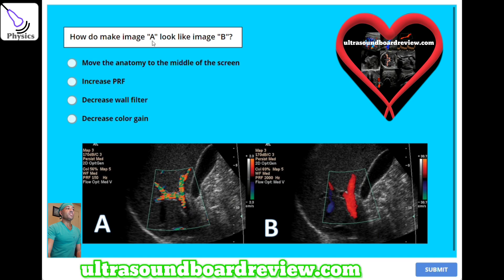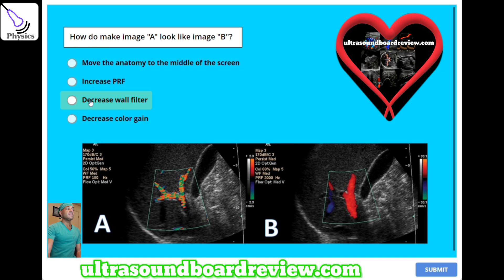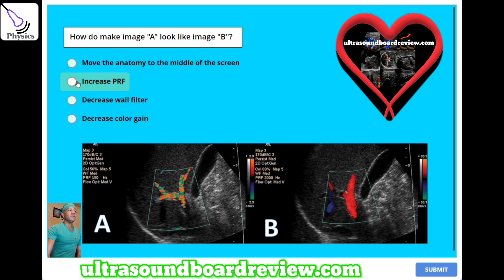How do you make image A look like image B? A, move the anatomy to the middle of the screen. B, increase PRF. C, decrease wall filter. Or D, decrease color gain. The answer is B — increase PRF to eliminate this aliasing Doppler artifact.